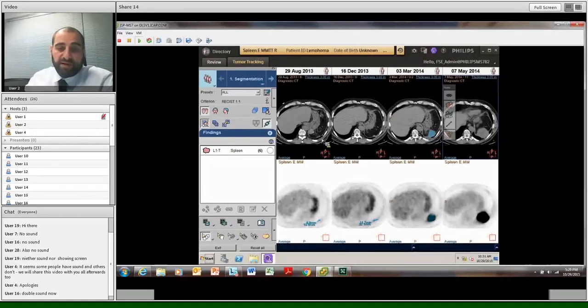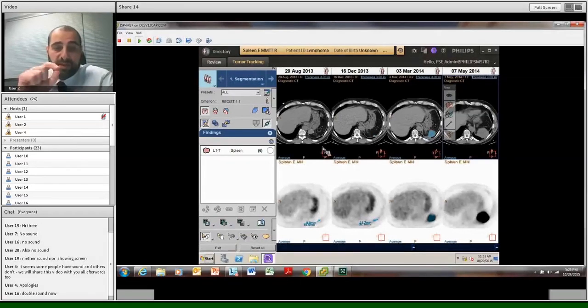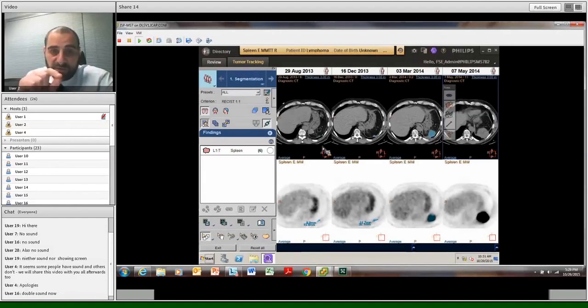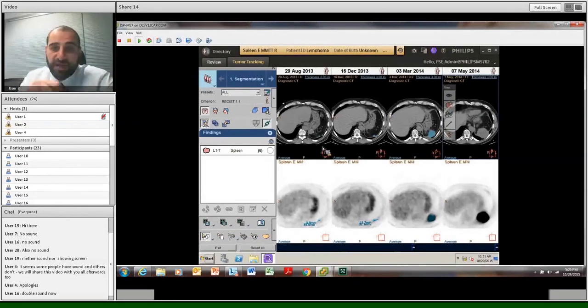And now, I'll ask Yannika just to show us live in Telespace Portal how we look at multimodality imaging of lymph nodes within the abdomen.